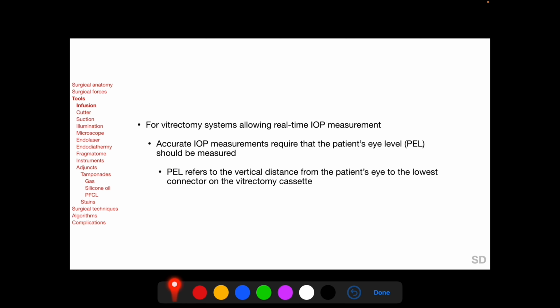Suction generates flow within the vitreous cutter from the eye to the machine, which imbricates tissue within the cutting port and aspirates the tissue after it is cut. A separate suction line is available on most machines for the extrusion cannula, which we'll discuss later. Parameters such as suction, cutting rate, and power should ideally be under linear control with the foot switch.